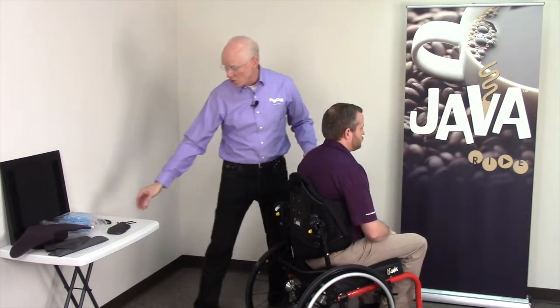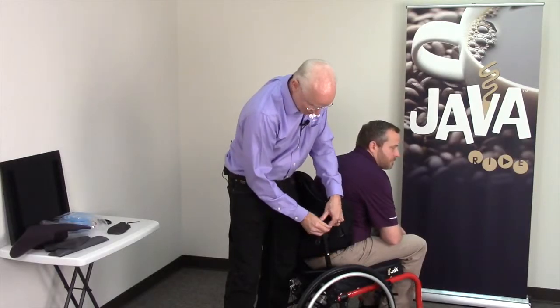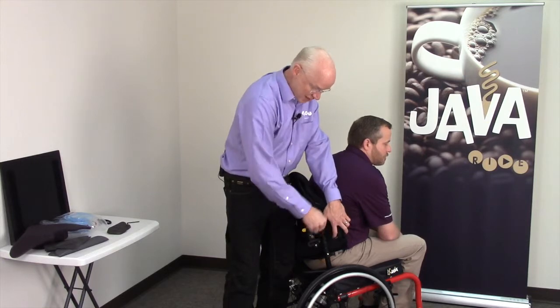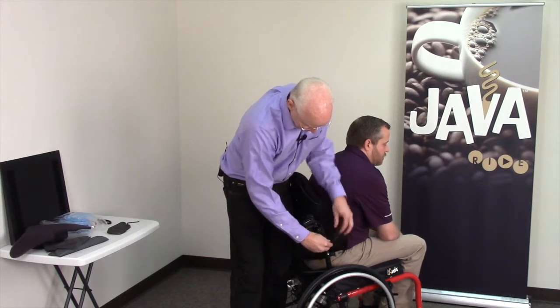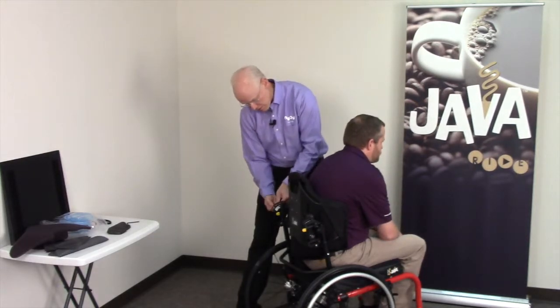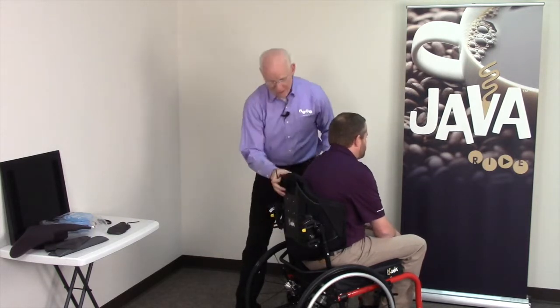So right away, I'm going to go to my depth adjustment on the Ride Java back. What I'm going to do first of all is get him back on the cushion. One of the nice things about the Ride Java back is that all of these fitting adjustments I'm doing are independent. I can do the right side while he's still sitting in it safely, and that's the only thing I'm adjusting, depth. So I loosen up my depth adjustment screws, and I tighten those down. Go to the other side. And again, the back just slides right back. Okay? Hardware is loose. I'm only adjusting depth.